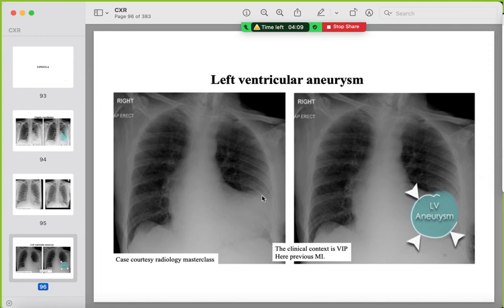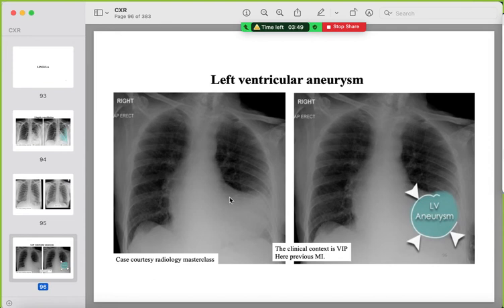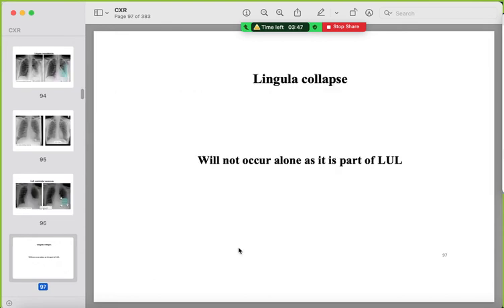A mimicker for the left heart border silhouette sign: a rounded opacity with calcification in its wall in a patient with previous myocardial infarction — this is a left ventricular aneurysm.